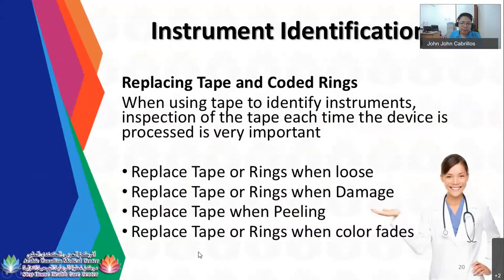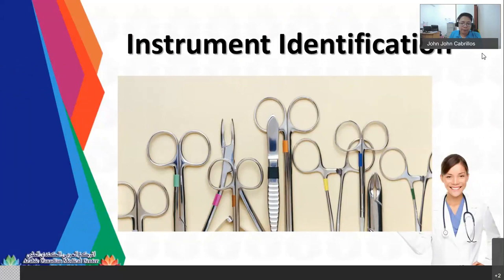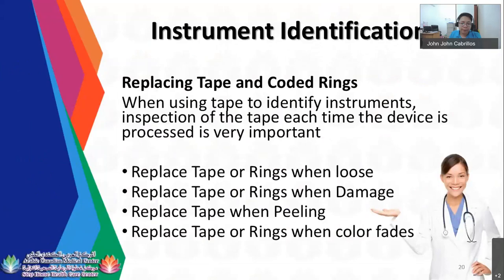So for example, replace the tape or rings when color fades. The reason why, for example, this is your pink color or your blue color. Your blue color, your pink identification color-coded tape. Time passes by. If it is used often, then there's a possibility the color will turn to black. Then you cannot identify if it is blue or black, or if it is red or black. So it will darken as per longer usage of the tape. So usually we are replacing the tape once a month or as necessary.